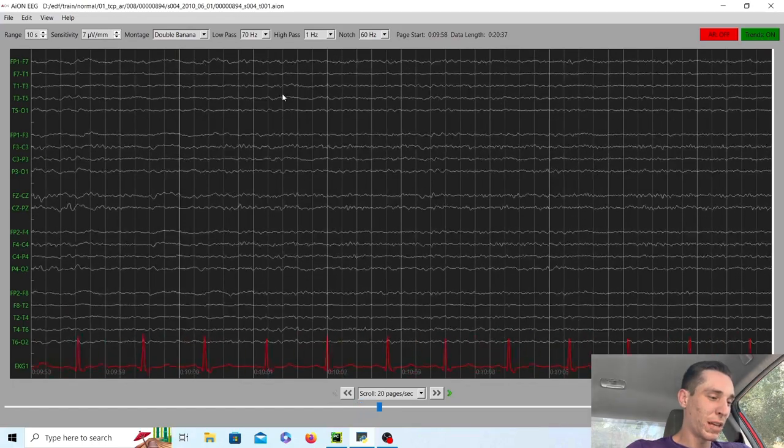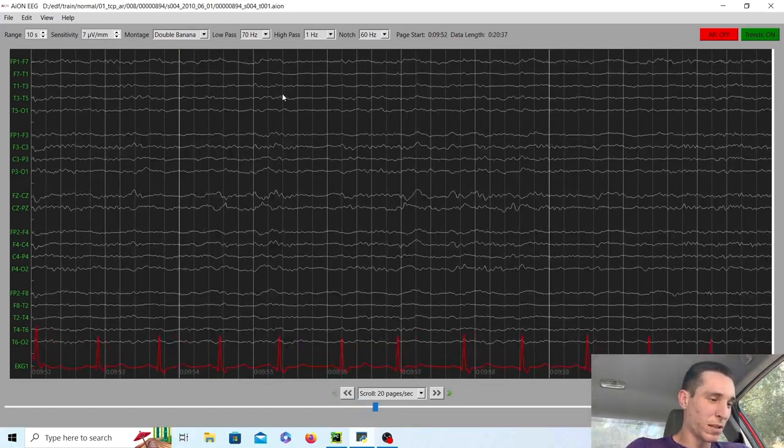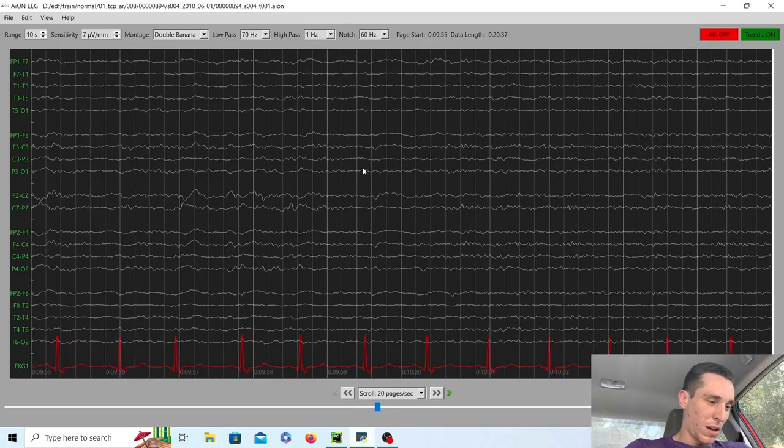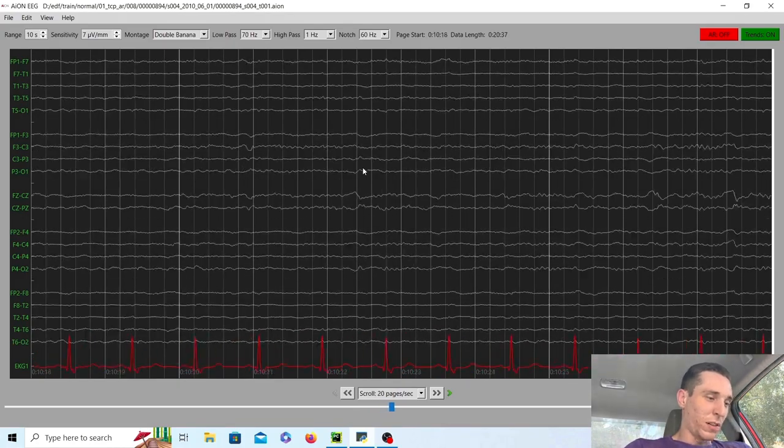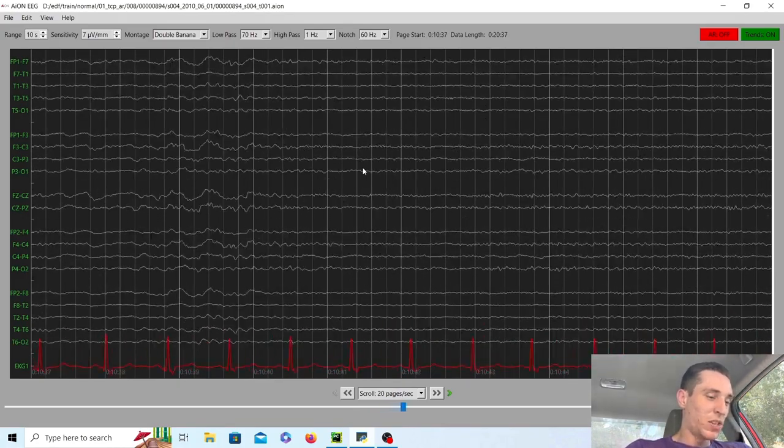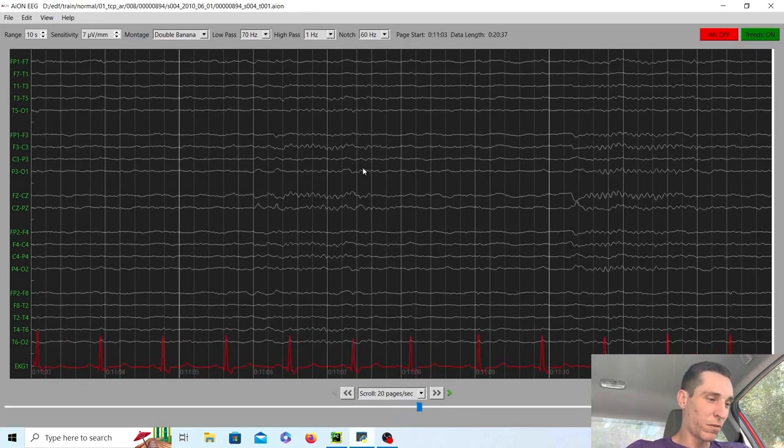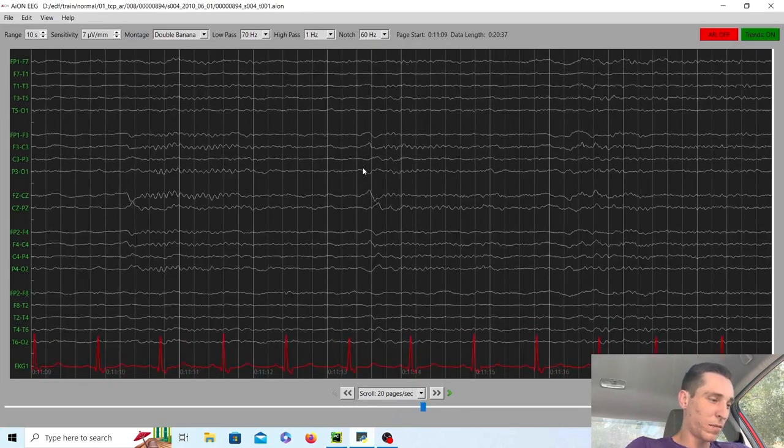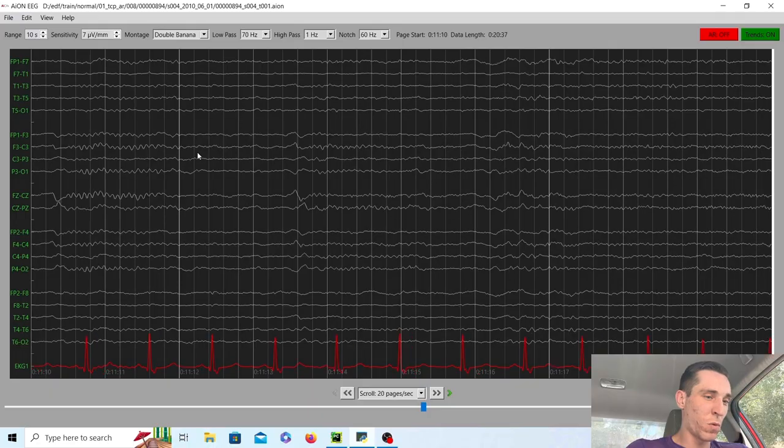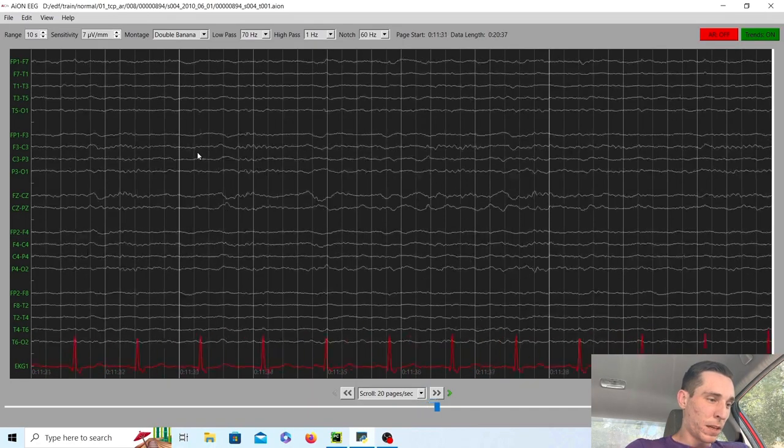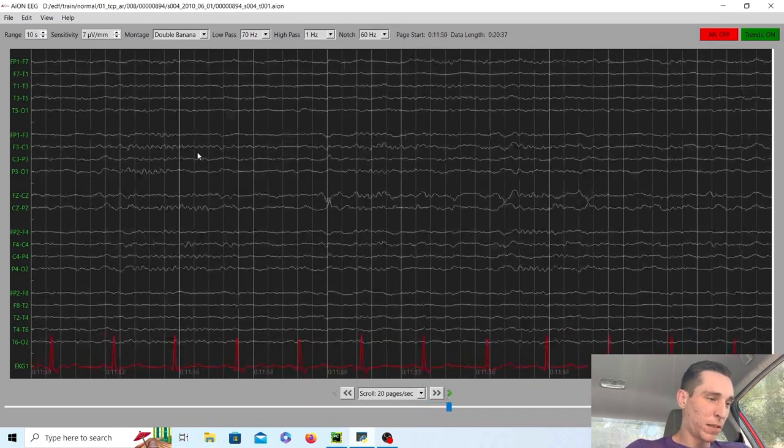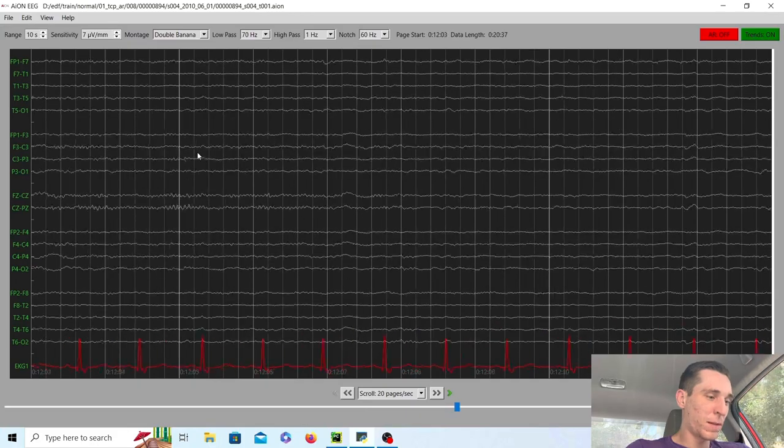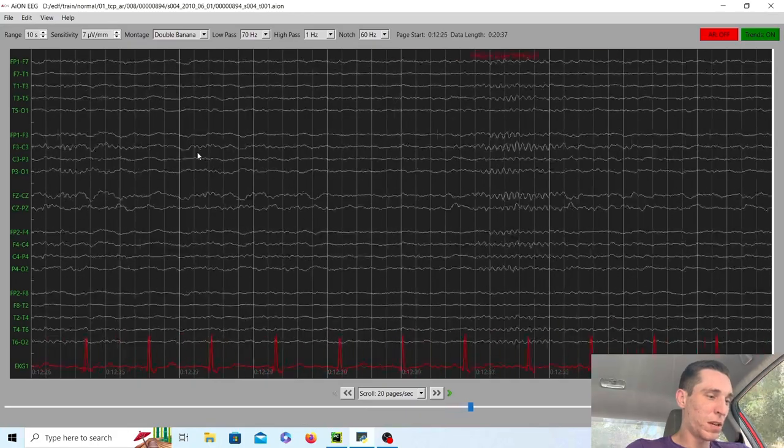And as we scroll on, we continue to see a good sleep structure in this normal EEG. We go a little faster. We start to see the sleep spindles come out even more. And definitely stage two sleep right now. Beautiful EEG.